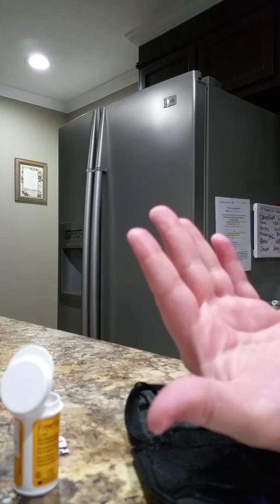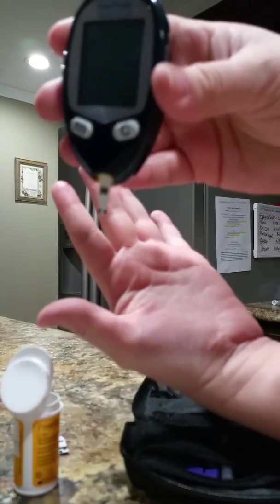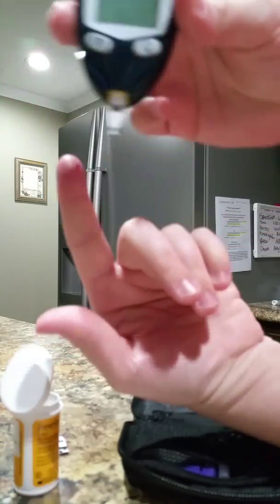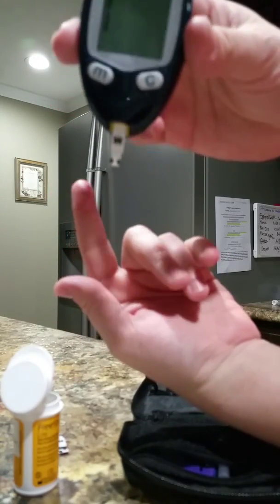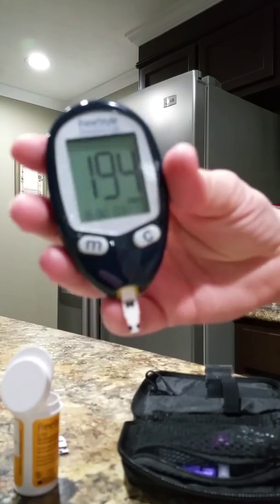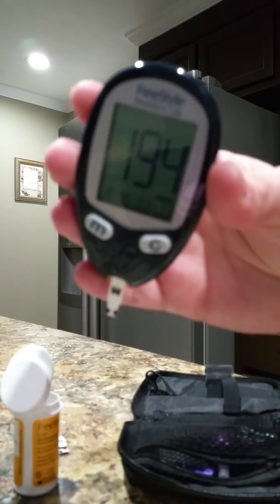Okay, then I have to put my strip back in because it timed out. But then, you just take your little meter. You can see mine's ready. And you just set it against the blood until it beeps. Okay, so my blood sugar is high right now. It's 194.